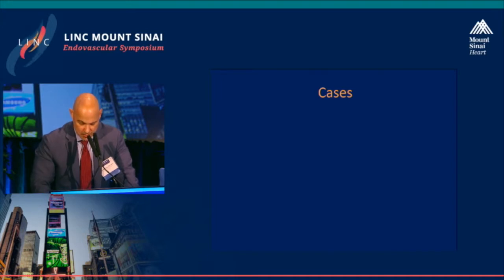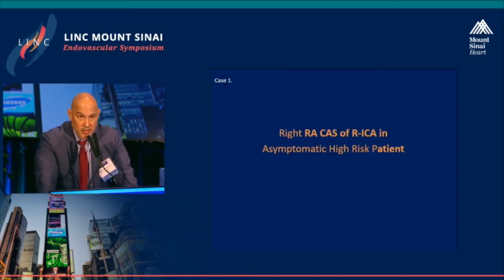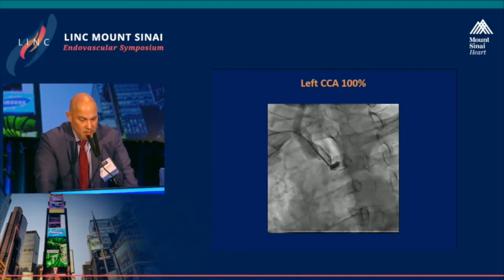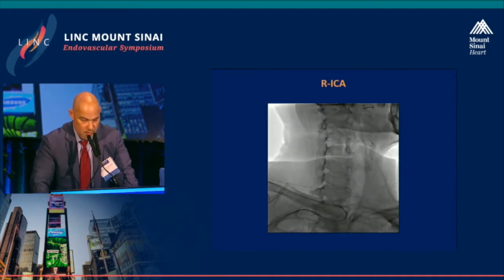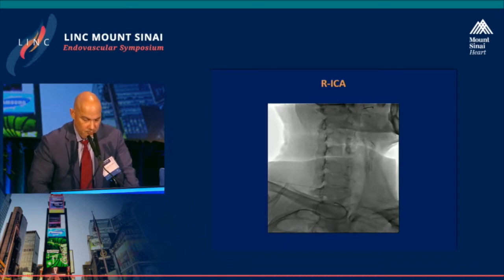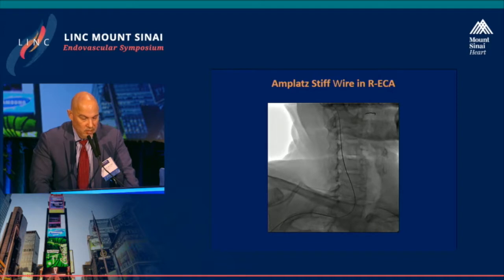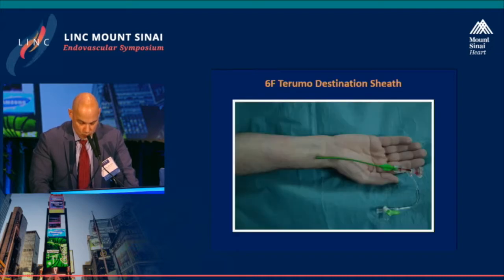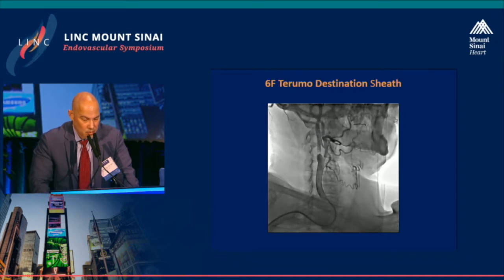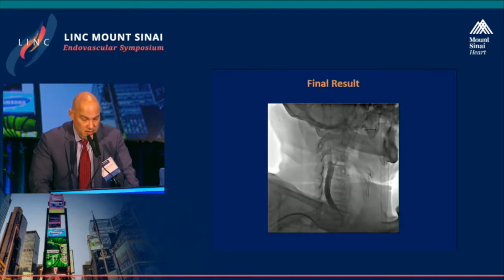The first case is a right radial artery carotid stenting of the right internal carotid in an asymptomatic high-risk patient. The left carotid is completely occluded, and the right has a very severe proximal ostial lesion. We advance a steerable wire and catheter into the external carotid, exchange for a stiff wire such as an Amplatz or stroke wire, and then advance a sheath — in this case a TRUMAX destination sheath — up to the distal common carotid. We then advance a wire and filter, a distal protection device, and the stent is deployed.